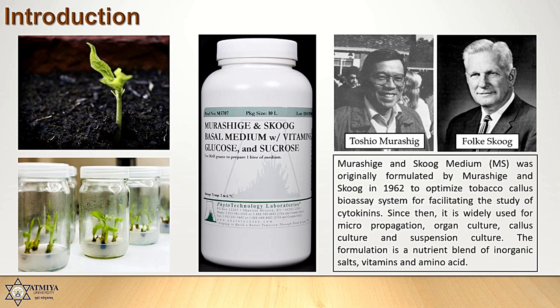So, what is its recipe? What concentration of nutrients is required for the media? In this virtual lab session, you will answer all of the above questions, with a short description of components of the media. You will also find a handy chart that you can keep with you while preparing the media in your lab.